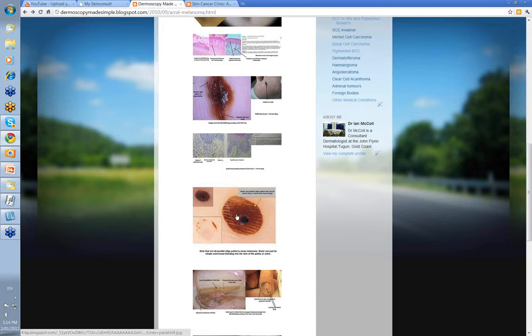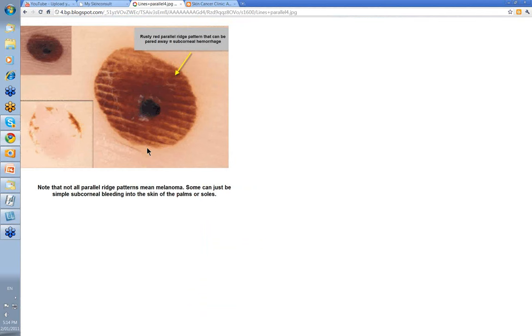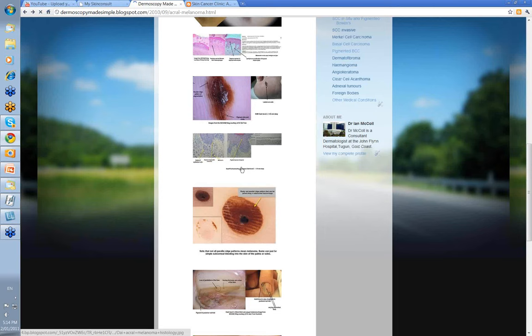So what's your differential for a parallel ridge pattern? It's a sub-corneal hemorrhage — bleeding just underneath the stratum corneum, sometimes called talon noir, a frictional injury seen in basketball players or people with occlusive footwear causing friction on the heel. All you do is take a blade and trim it — it has that rusted blood appearance and you can trim the whole thing away. So not all parallel ridge patterns mean melanoma; some can be simple sub-corneal bleeding.